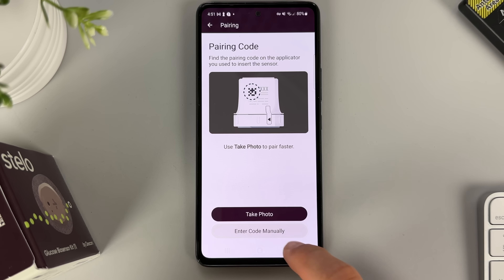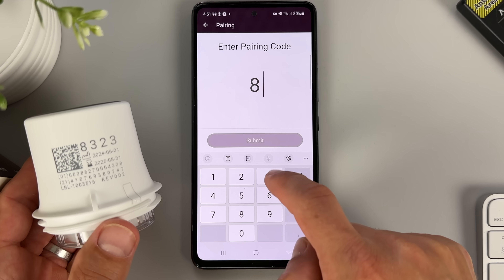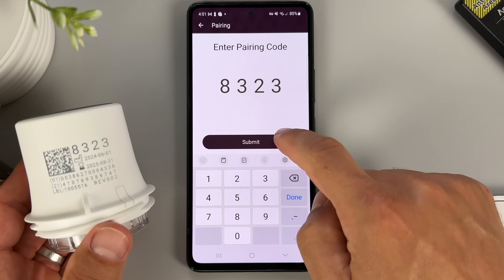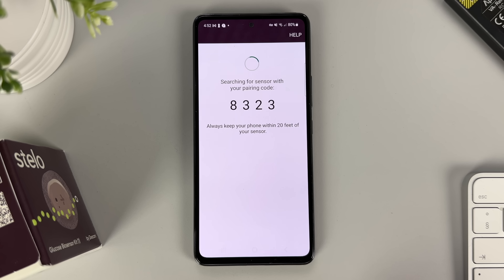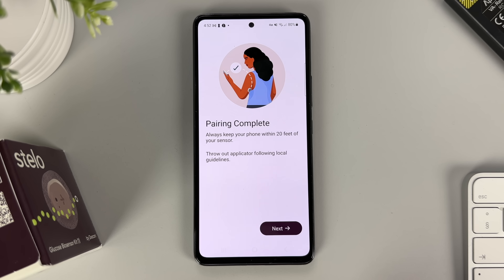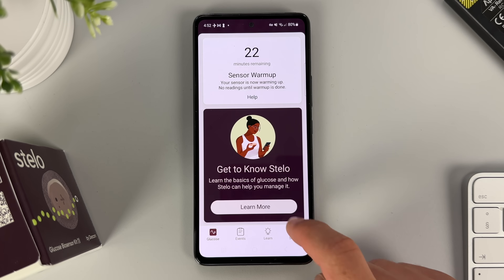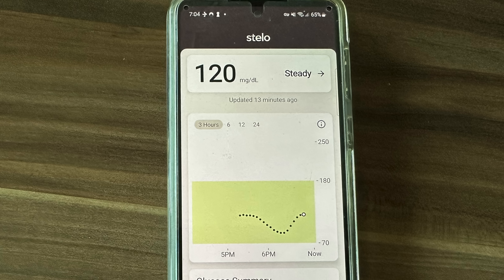Before we got our Stello session started, we needed to pair the sensor with our phone. To do that, you either enter the pairing code manually or scan the QR code from the applicator with your phone. As soon as you do that, the sensor pairs with your device and you'll see how many minutes are left from the 30-minute warm-up. In our case it was 22 minutes — 8 minutes had already passed since we applied the biosensor. After that we got our first reading, and then another one, for the next 15 days.